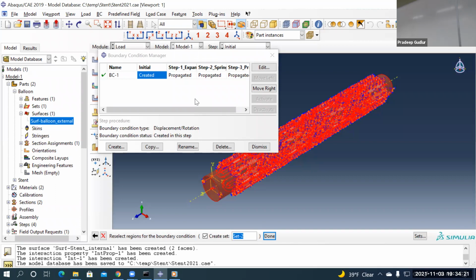Yeah, the coordinates. I use 0.5 or Z is equal to 0, or otherwise X and Y equal to 0. So if the coordinate system is not done properly, it's not showing those arrows.